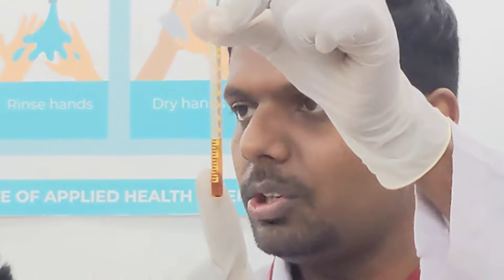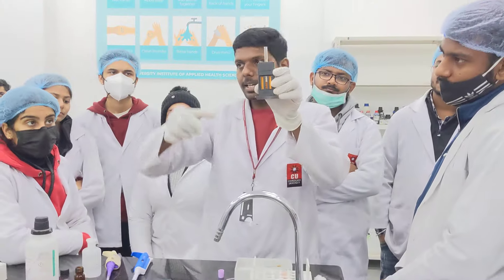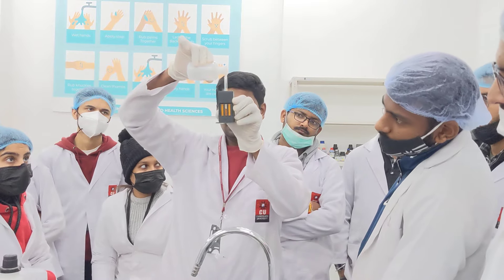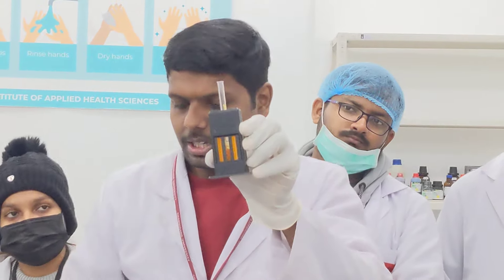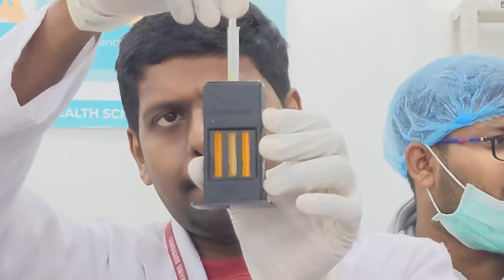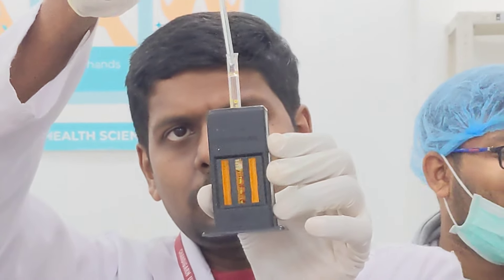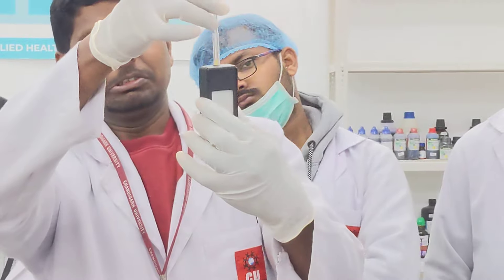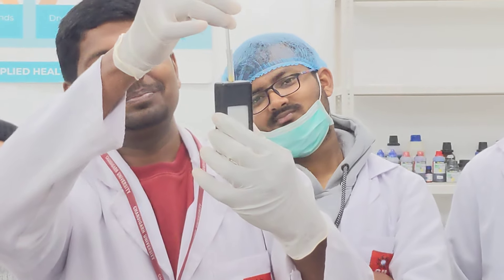Now this needs to be diluted by comparing it with the standard comparator. Keep this in the standard comparator and start adding distilled water drop by drop. I added a few drops of distilled water and am going to mix it.